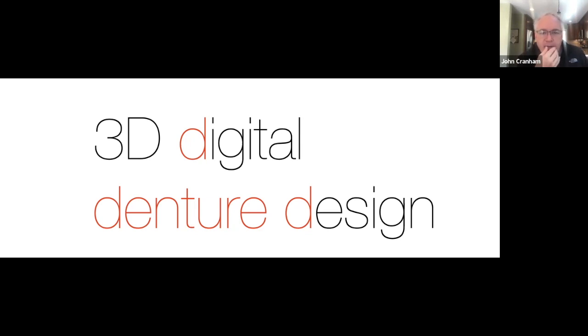What glue is used connecting the teeth to the denture, to the partial denture framework? So same thing. I've got a milled PMMA little section of teeth, and we're going to bond it to the framework. So it's the same as bonding those 6 teeth to a partial framework as a full arch to a bar. We're going to prepare the inside, sandblast and connect on the PMMA. And then we're going to sandblast, monobond, and then multi-link cement to put them all together. So the process is exactly the same for putting teeth on a partial as putting teeth on a bar.